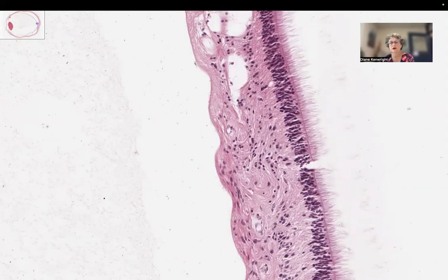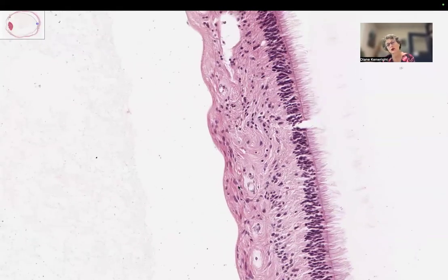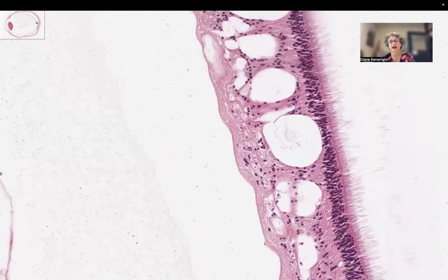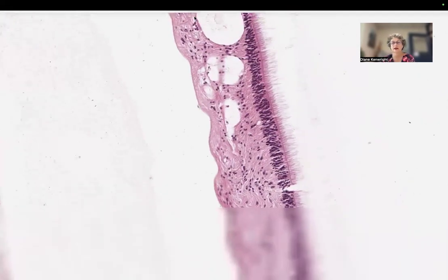So we've got retina, outer nuclear layer. The inner nuclear layer has gone just about, and there's still no ganglion cells, but these are the new vessels here and some collagen fibers that are forming this fibrovascular membrane that is contracting. This would contract and pull off. This would cause some tractional detachment. We can't actually see it here, but causing the wrinkling of the anterior retina. This vessel here, it's not great for a diabetic vessel. We'll have a look at the choroid in a minute and see if we can see anything.